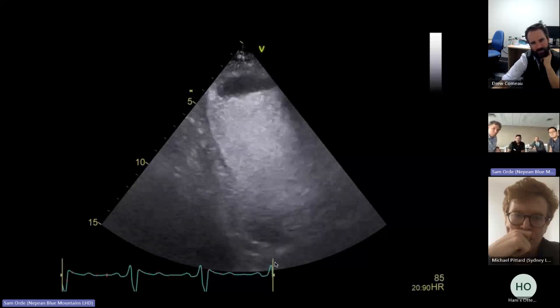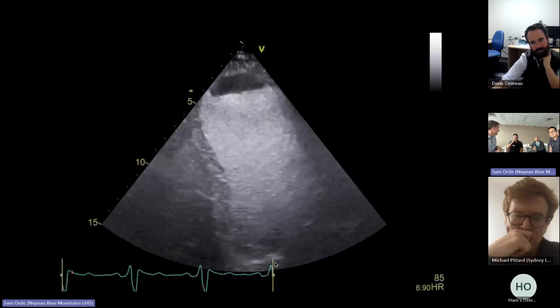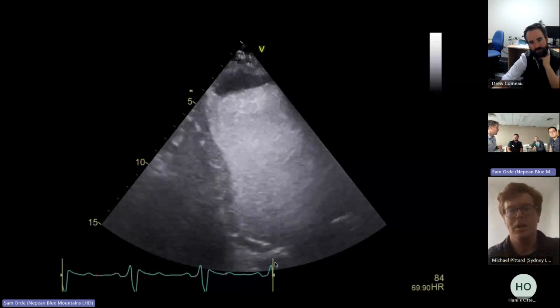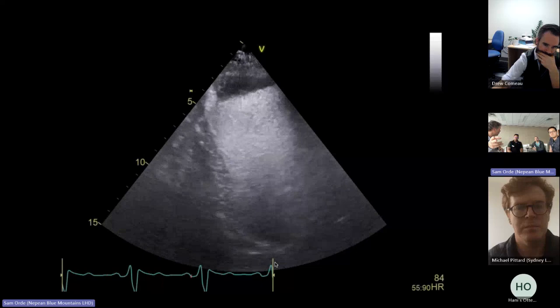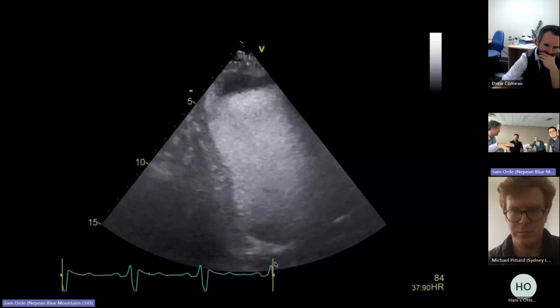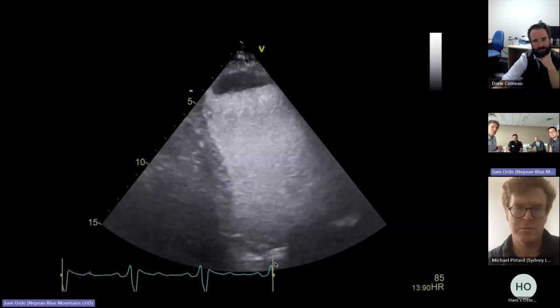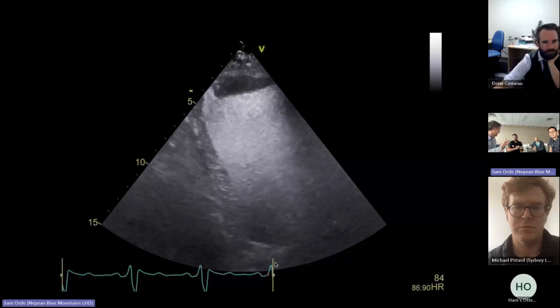Just with the focal points there. So what's the right position? Some people keep it away so that it does not destroy the bubbles. Yeah, some people keep it. Yeah, what a great question. I think it's probably splitting hairs when you're imaging at 0.1 of a mechanical index. It probably doesn't matter too much. I think that's been left over from when we were imaging the apex when we were in 2D. So it shouldn't matter too much, I think, when you're doing low mechanical index.